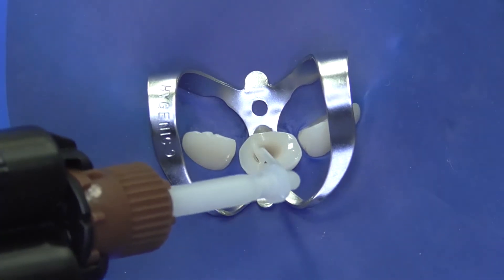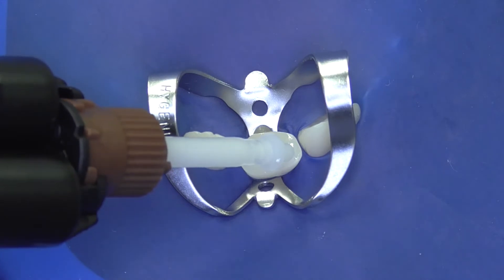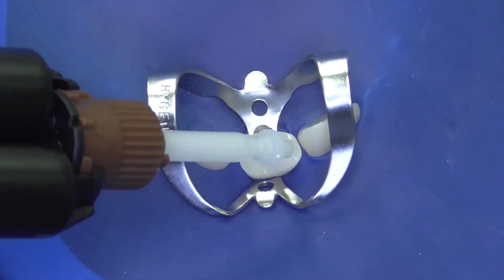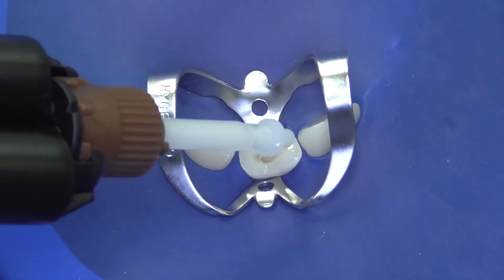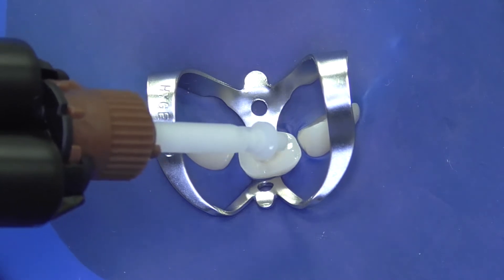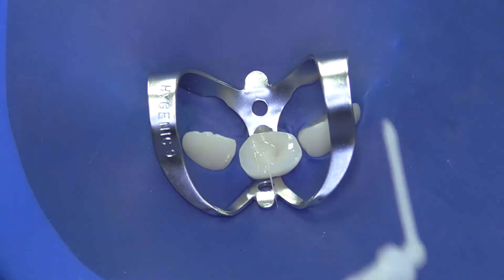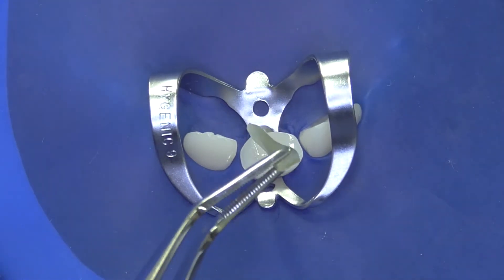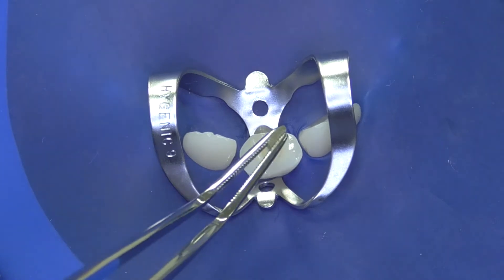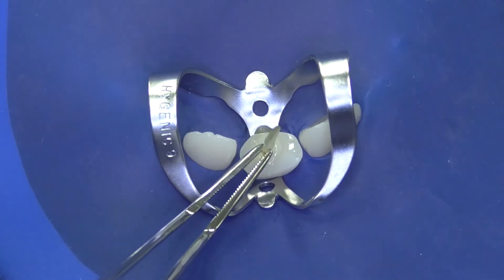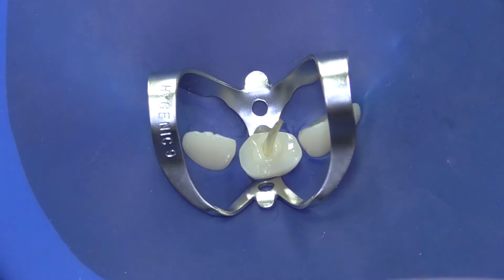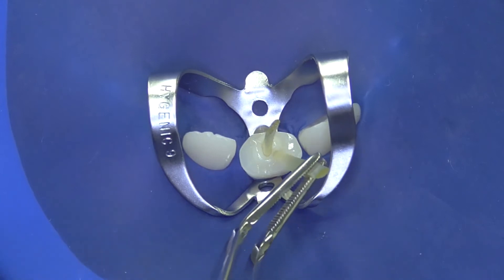Before it starts to set, we are inserting the fiber post, all three pieces of fiber, to the root canal, ensuring that the longest one will go to the deepest part of the root canal opening. Our intention here is to fill the entire coronal opening with as many fibers as possible.